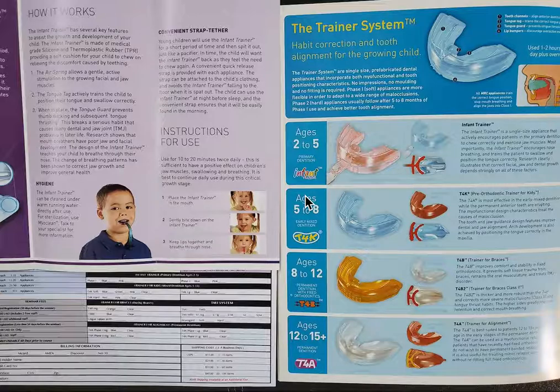If you're starting to see some issues of bite problems, of narrow arches, underbites, overbites, this is a great way to get started in young kids before you're ready to get moving with another set of appliances to actually fix the bite. So in terms of what I would charge, it really depends on what country you're in. Most of my doctors are charging a D8210 for this. So it's a removable appliance therapy for oral habits for the most part.